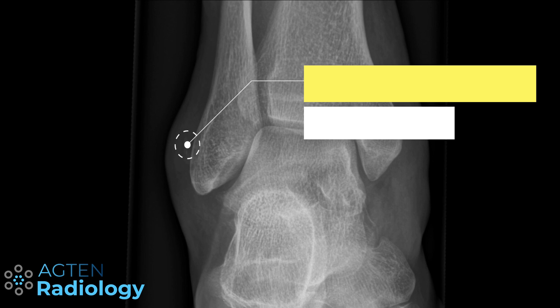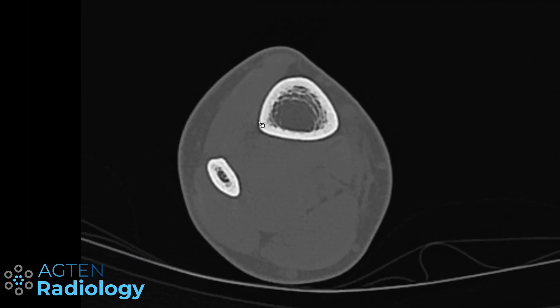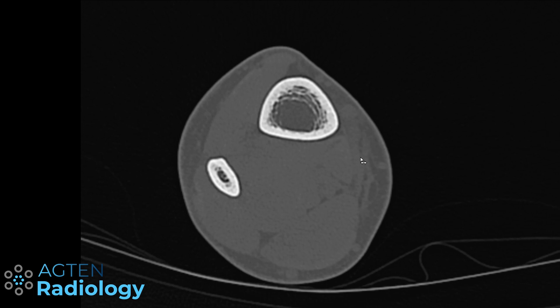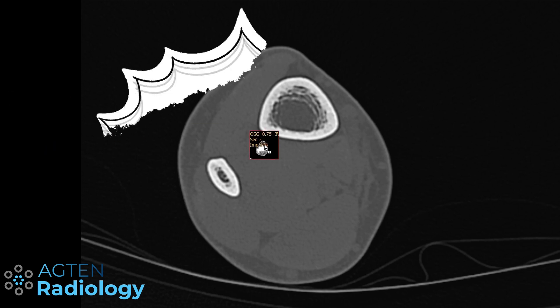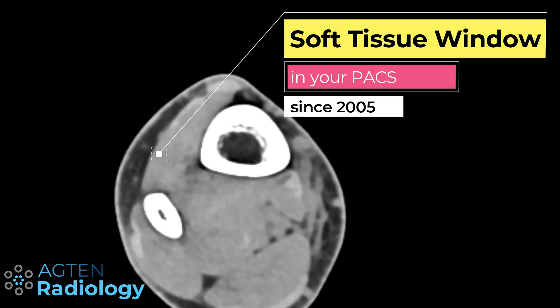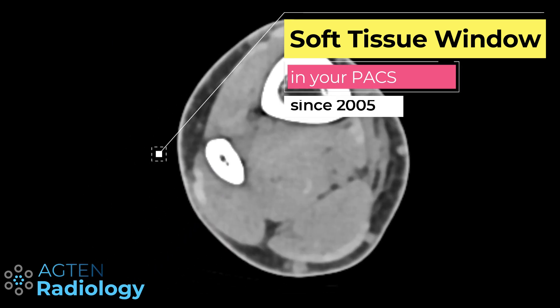The key lesson here is to always look not just at the bone window, but actually at the soft tissue window as well. Just do it! This is basically key because tendons are very dense and you can easily identify them.